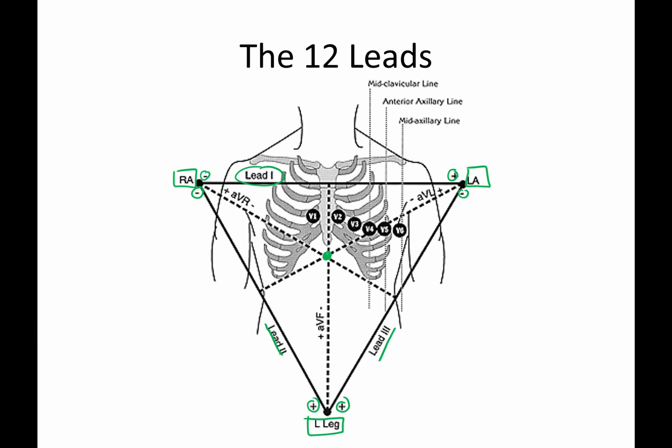What's really cool is going from the center here, going straight down, you have AVF, which says it's positive down here, and assuming the central node is negative. Your AVR and your AVL function in the same way and are measuring out in these directions. Those have all been stacked up into the tightest, smallest representation.